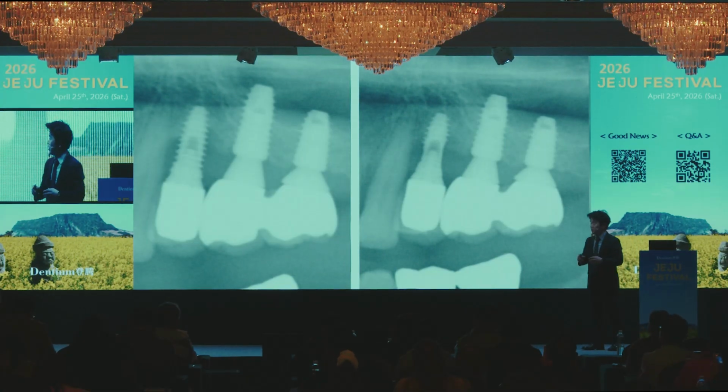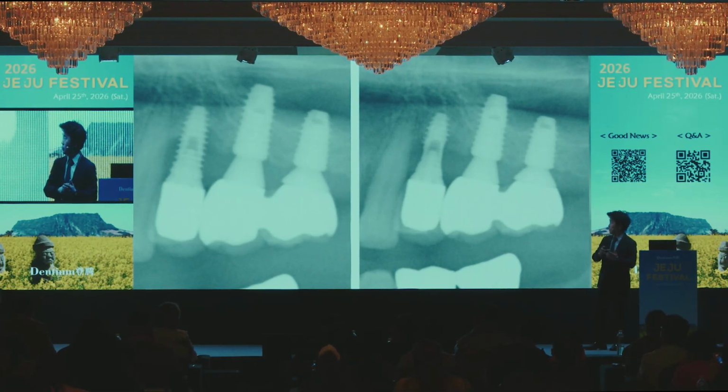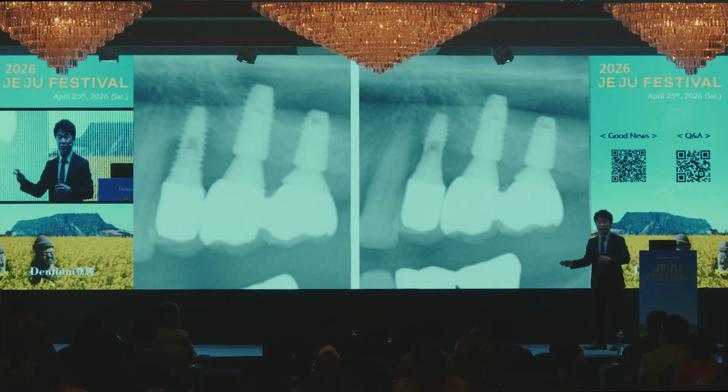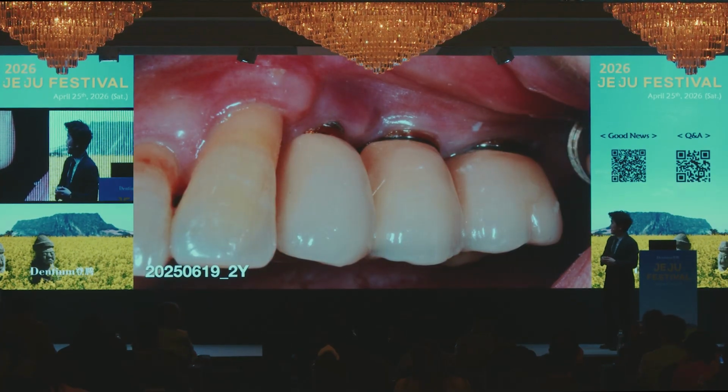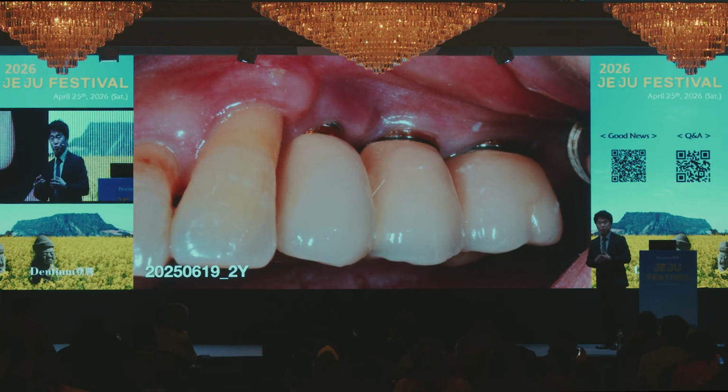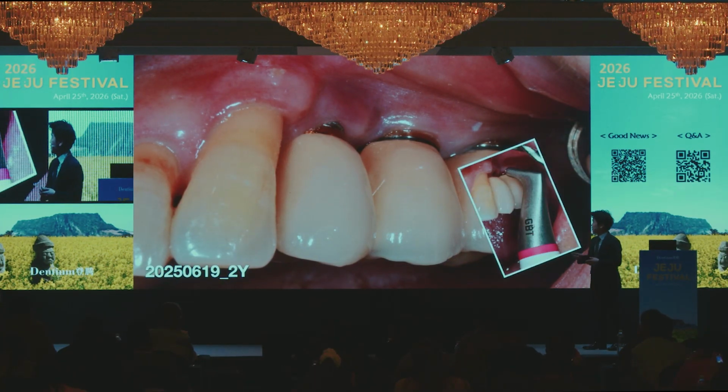This radiograph is a comparison before polishing and after polishing, so-called implantoplasty. And then the two-year follow-up. She has good compliance, so every three months she came here. She came to me, and then airbrush and TBI also, such as this.